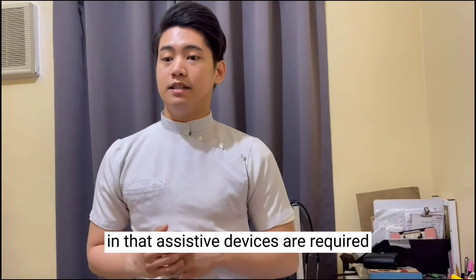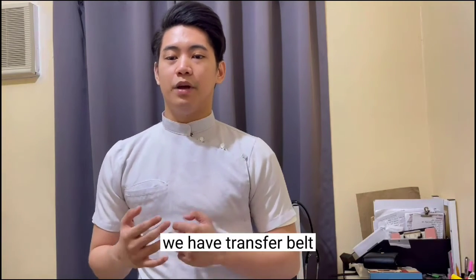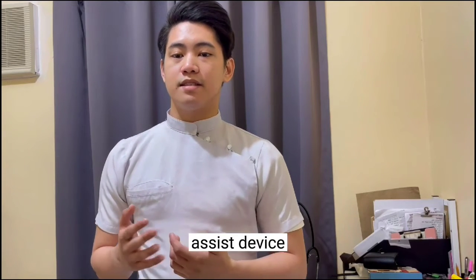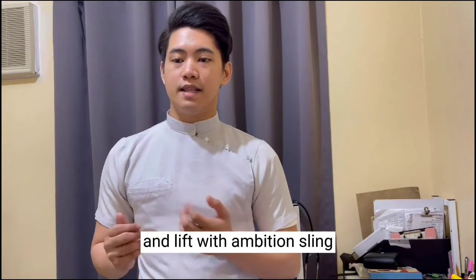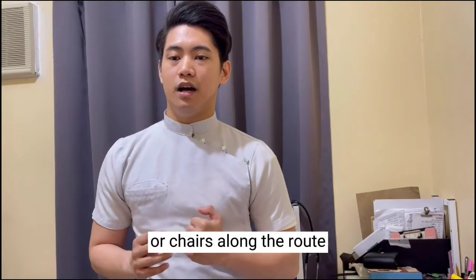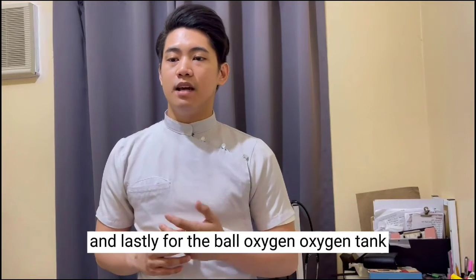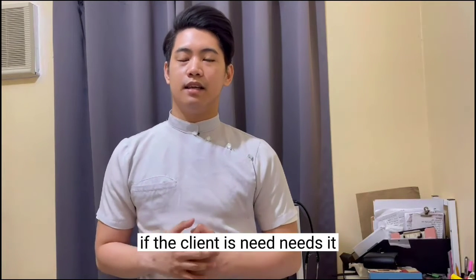For the equipment needed, assistive devices required for the safe ambulation of clients. For example, we have transfer belt, walker, cane, sit-to-stand assist device, and lift with ambulation sling. Also we have a wheelchair to follow the client, or chairs along the route if the client needs to rest, and lastly, a portable oxygen tank if the client needs it.